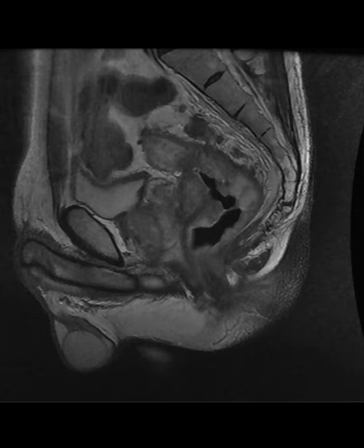Wait, so were you able to definitively say that in this case it was MSS versus MSI? Yeah, they did a pathology. Oh, was it retrospectively only, or is it at the moment you read the case? Oh, no, it was when they do pathology, they stain for these things. And I just wanted to learn more about it because that's one of the things that they do to prognosticate the patients and figure out what to do for the patients. And I think, just because it's heterogeneous, I don't think we can just say this is MSI.